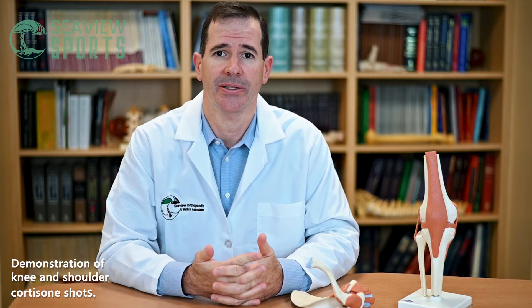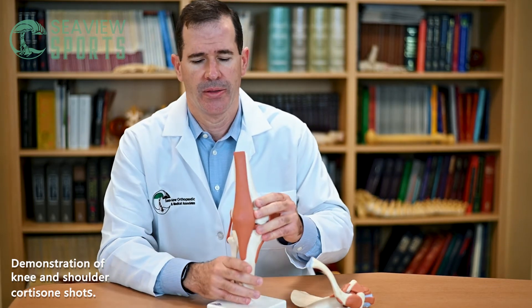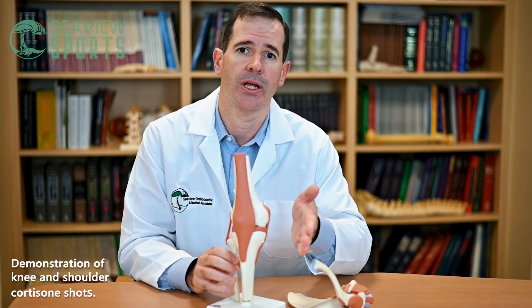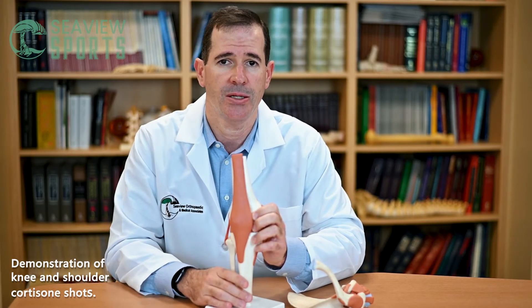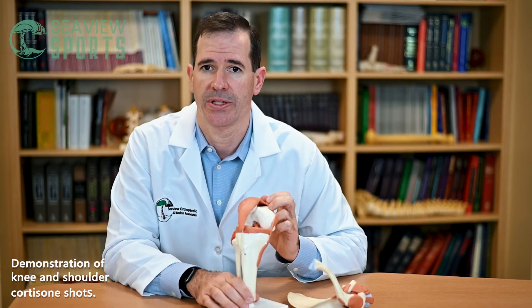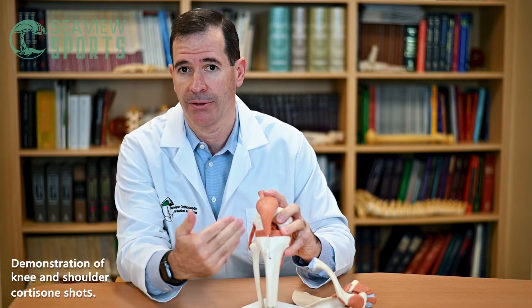A very common question: how is it done? The knee, for example, is one of the more common joints that we inject. Arthritis is the most common reason for this injection. This is a standard knee — this is the outside, or what we refer to as the lateral aspect, while over here is the medial aspect. Majority of the time, individuals have pain along the medial side. There are different ways to approach the knee depending on the individual's position. Most commonly, we have the individual sitting with their leg over the side of the bed so that their knee is in a bent position. In such a position, we typically come from the lateral or outside portion.